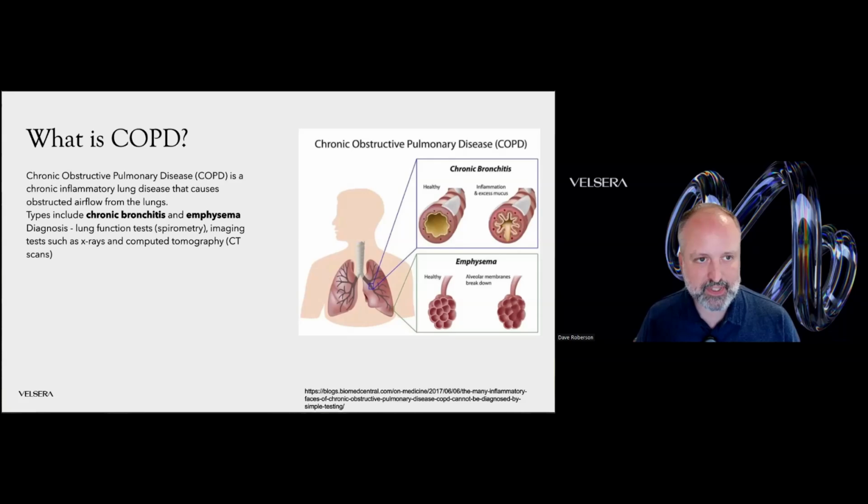So where the chest imaging platform comes in is, how do we digitize this? How do we use machine learning or AI to be able to predict progression of COPD earlier and earlier? And you can imagine, any type of lung tissue, so even lung cancer. This is a question for this community. Could you use the chest imaging platform to diagnose progression of lung tumors?